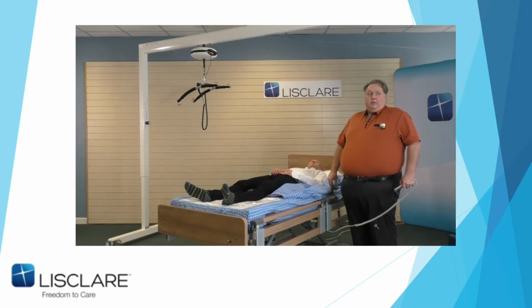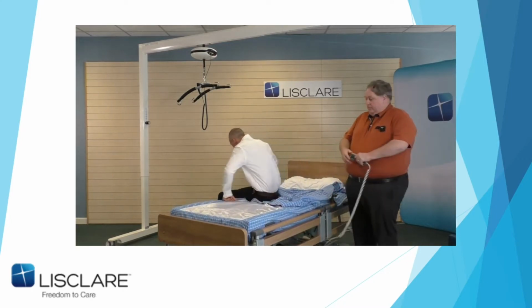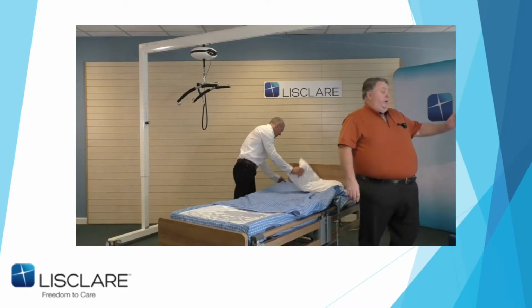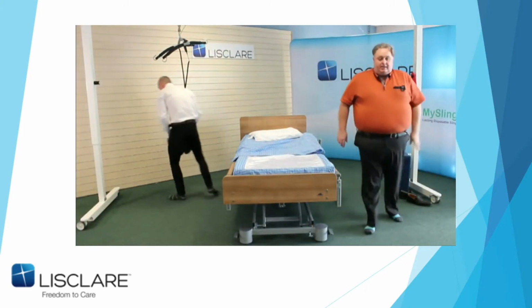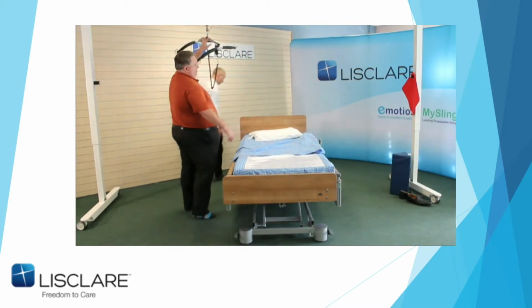Obviously lowering it down, it's high enough for John. Now, what we're going to use now is the gantry for this, because obviously my body mass is slightly more than John's. I'll just leave my socks off for this one, my shoes off. Yes, stripy socks. And if John goes round to the far side, I'll pass him over his hoist.